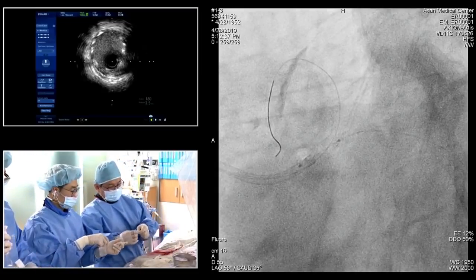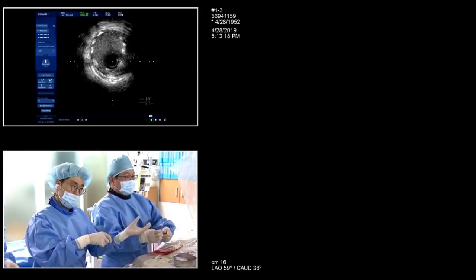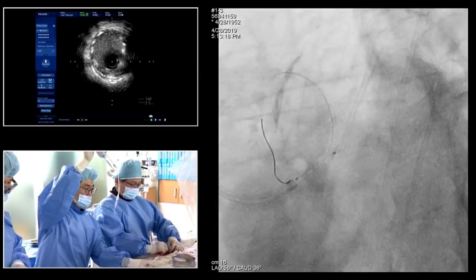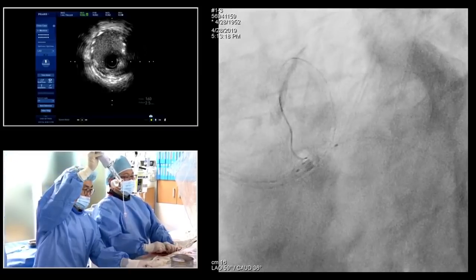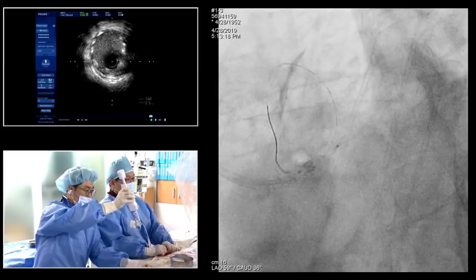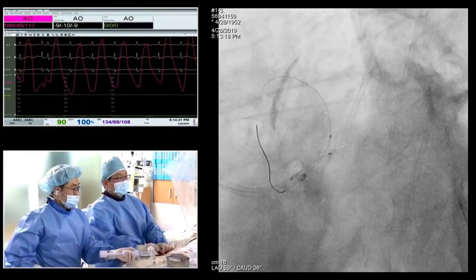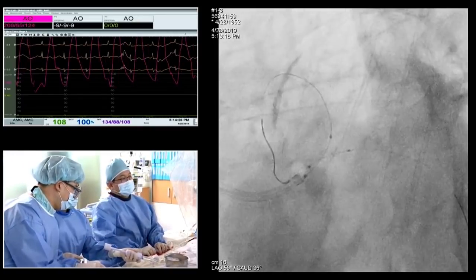Inflate first. It looks like the balloon was stuck. Yeah, I know. This is 3.25. I think we need to do a prospective randomized study when we use two stents in the left main to debulk the ostium of the circumflex. Great idea. Really debulk with DCA or Rota? Rotablation is not debulking. Rotablation is just plaque modification.